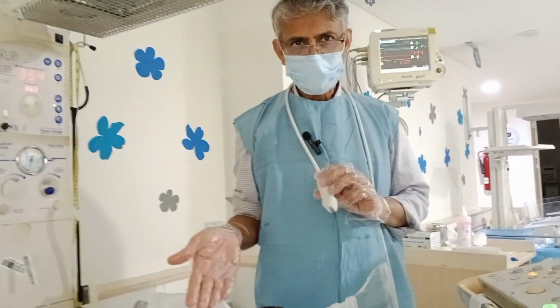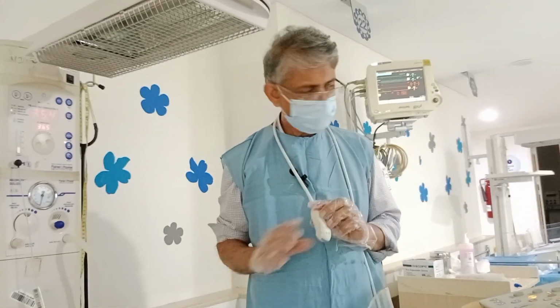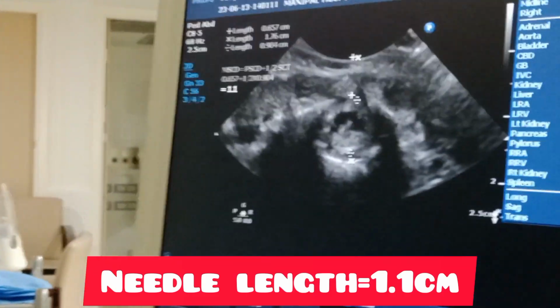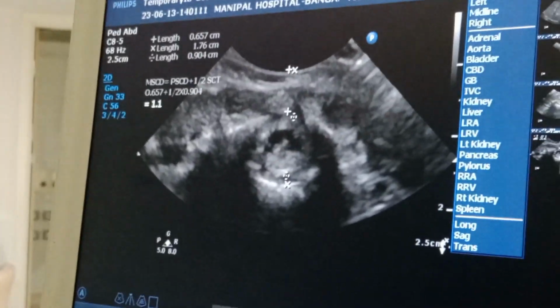Here we are dealing with a 40 weeks gestation baby, 4 kilos. So for a 4 kilos baby, the needle length should be around 1.1. So let us see what exactly we can get out of it practically.